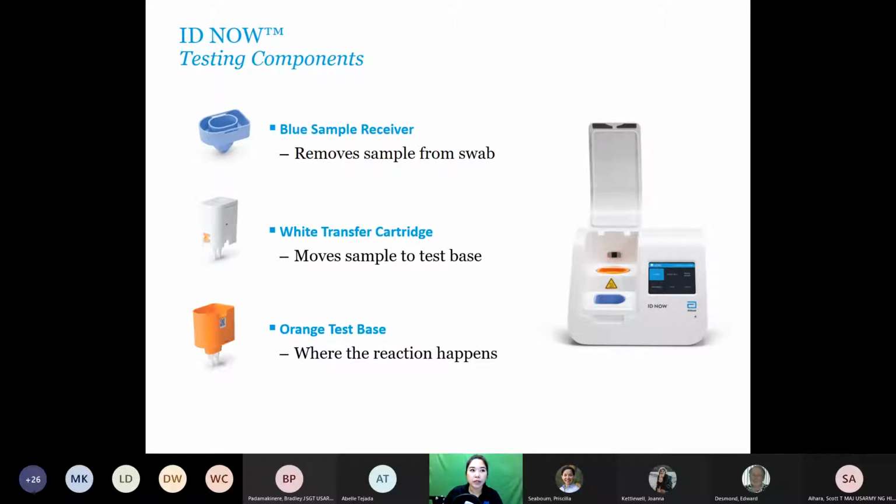So you're going to stick your swab into that big well filled with liquid. You're going to mix it around, and it's going to sit inside of this little warmer here. And that warmer is going to allow some time and a warm temperature to allow some of those detergents to get to the virus, break open that viral envelope, releasing the genetic material that we're looking for.